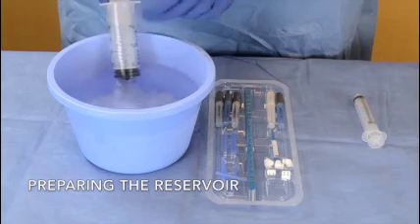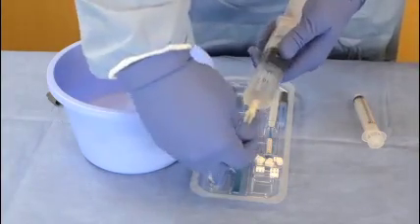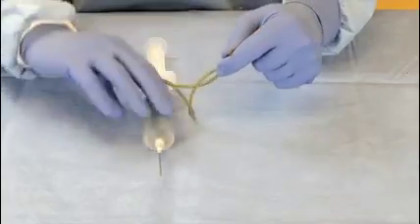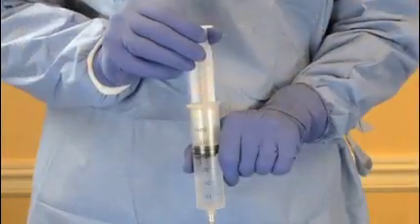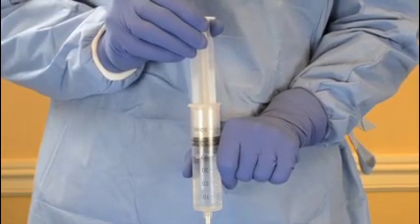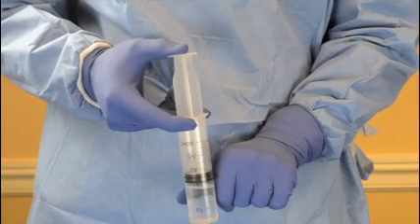Fill 1 60 cc syringe with 40 cc's of sterile normal saline and attach a 15 gauge blunt needle from the accessory kit. Begin with the reservoir in your non-dominant hand and squeeze as much air out of the reservoir as possible. Keeping the reservoir compressed in your hand, insert needle tip into tubing. Using a partially filled syringe, aspirate all of air from the reservoir. After air has been removed, inject sterile normal saline, approximately 20 to 30 cc's, without injecting an air bubble.